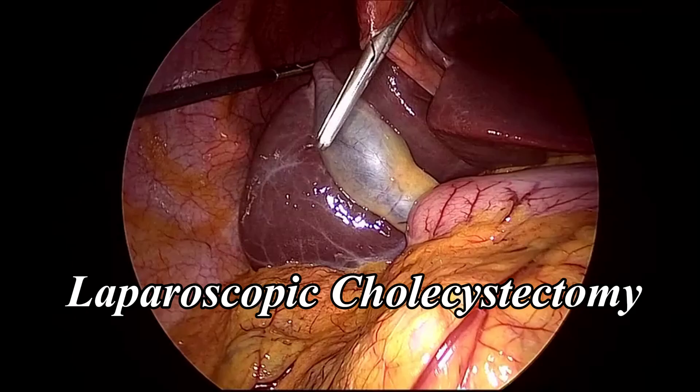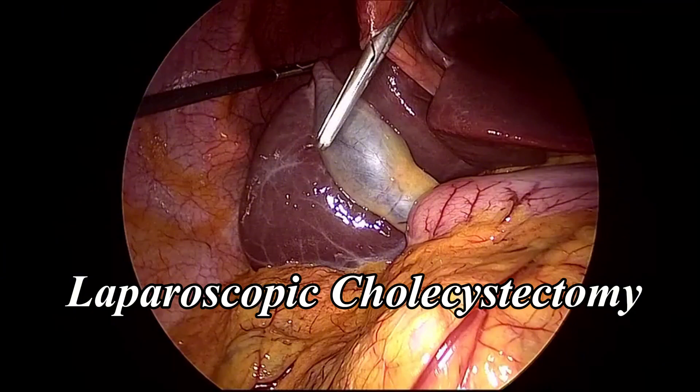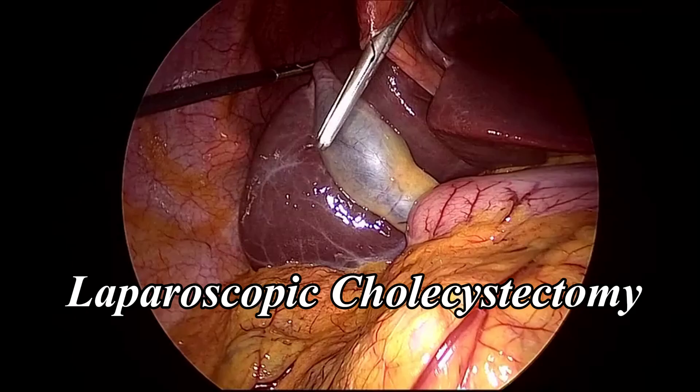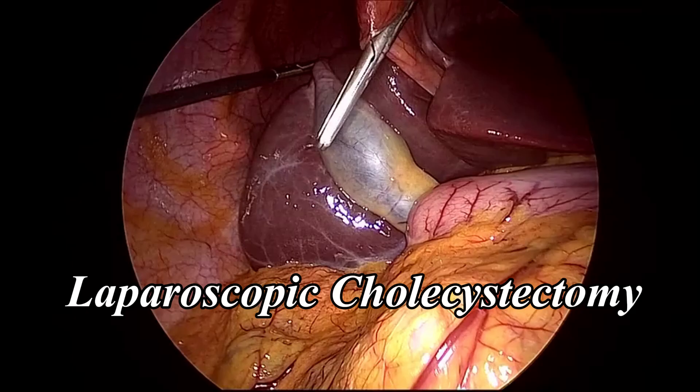Three additional 5 mm trocars are inserted: one in the epigastrium, the second in the right midclavicular line a few centimeters below the costal margin, and the third in the right anterior axillary line, slightly lower. This last port is often called the lateral retractor port. Pearl: maintain triangulation and adequate spacing to avoid clashing instruments.